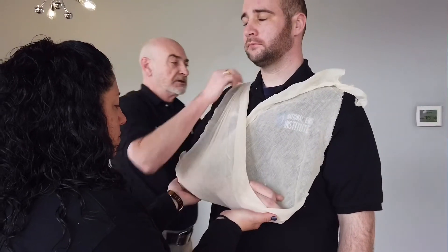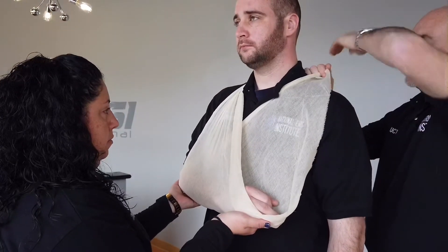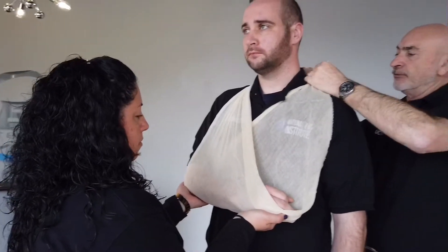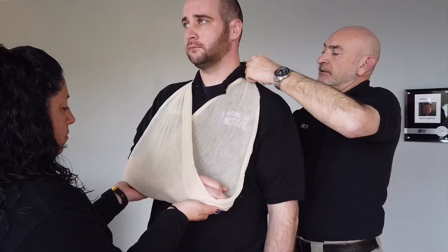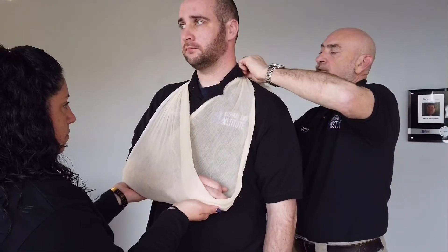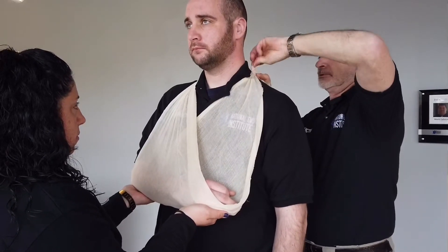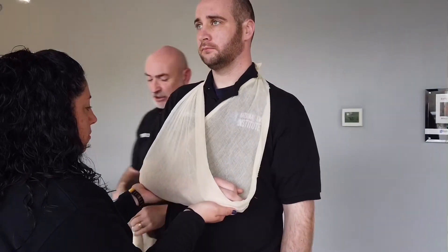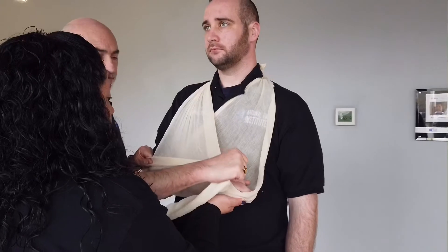Come around, tying this off on the backside — careful not to make the knot land up against the spinal column. I'm going to create a swath so the arm can't bounce forward.